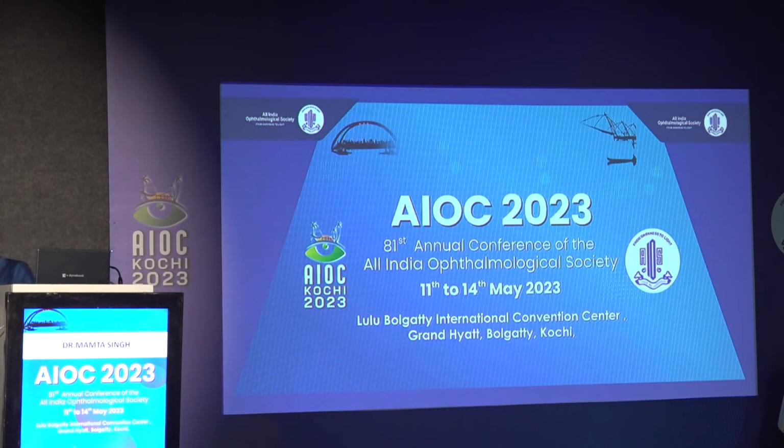Thank you, Dr. Mamta. So any guideline about when one should order topography in young kids, because these are the patients of early keratoconus? Yes, sir. We are seeing more vernal keratoconjunctivitis cases these days, and they have a tendency to continuously rub their eyes. So if there is a change in glasses, if the cylinder is more than 2.5, for me it is 2.5, but theoretically if it is more than 3 diopter of cylinder, then it's better to have a baseline pachymetry done. It will cost the patient probably 1,000 or 1,500 rupees.